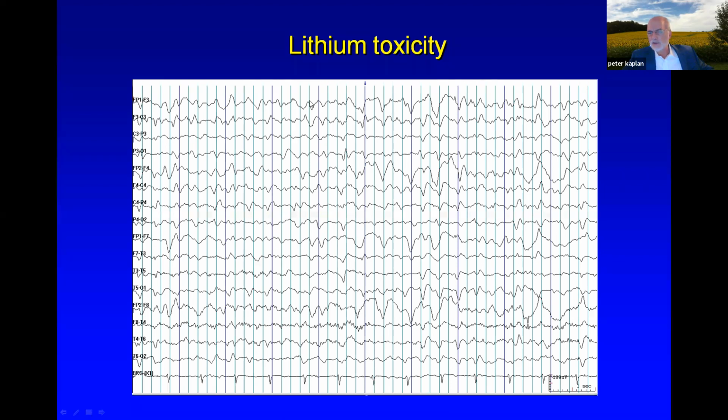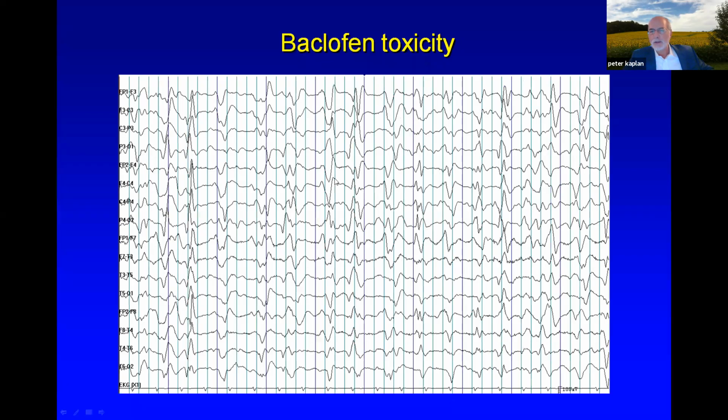You can normalize these things. You can normalize sodium, lithium, urea, and all that, but the EEG lags behind. Why? Because the EEG reflects the actual clinical state of the patient, not just the normalization of the blood, because stuff is happening in the brain and the encephalopathy is only beginning to regress even as you normalize the blood.